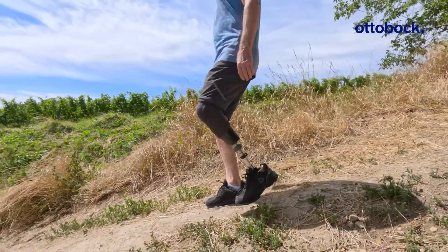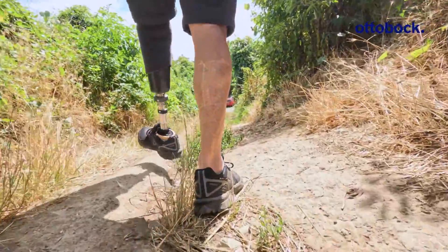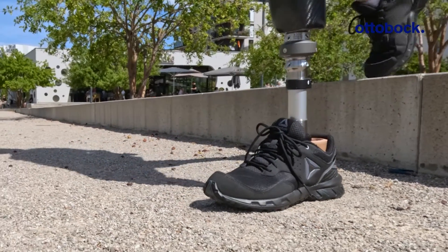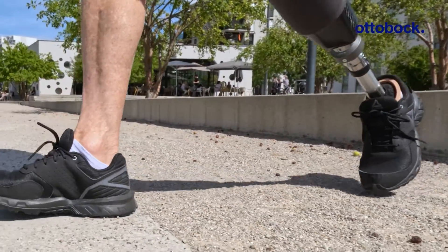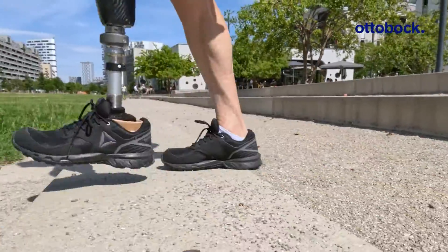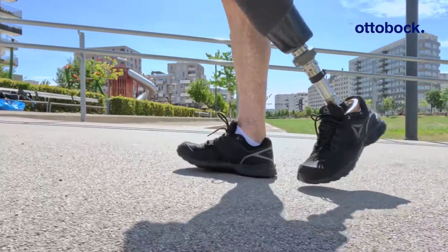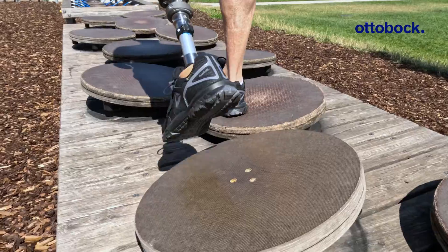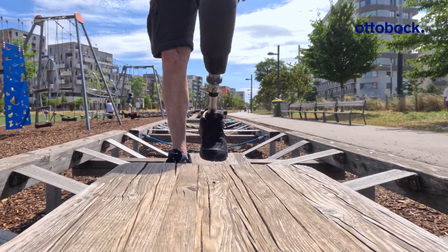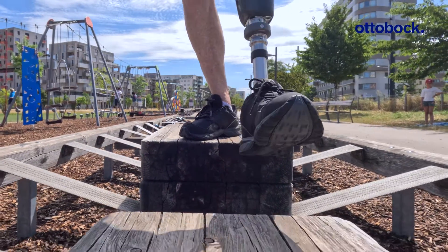The user perceives a very smooth heel strike and comfortable shock absorption, but also a very natural ankle movement. The applied energy is evenly returned to the user in a controlled manner. Active people quickly notice that Evanto is different from any other foot — the vertical compression and the multi-axial adaptation provide a new standing and walking experience.